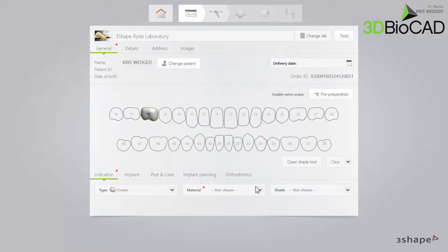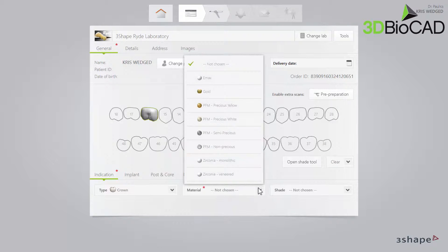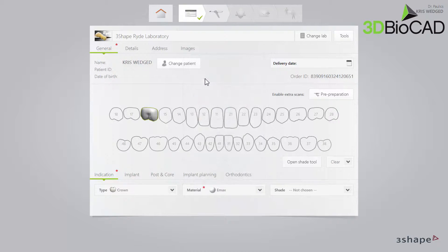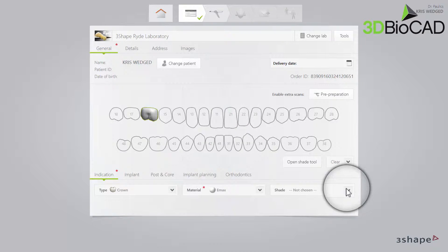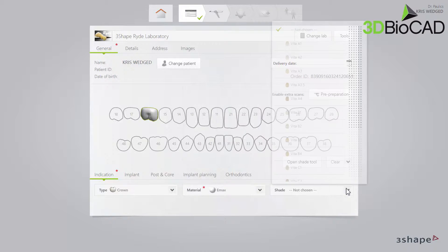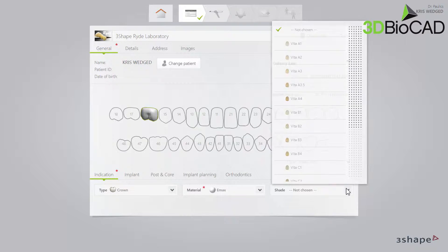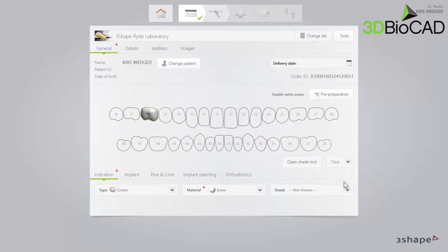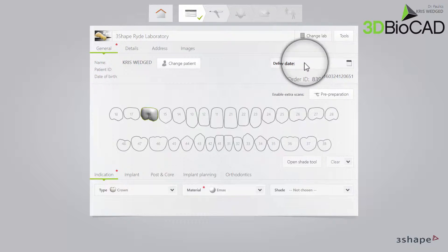Then select Material in the Material drop-down list. And if you have a pre-determined shade, select it in the Shade drop-down list. Finally, set the delivery date by clicking the Delivery Date button.